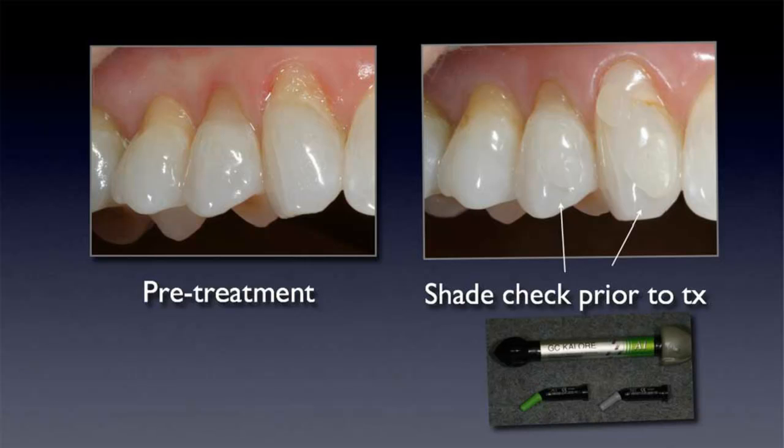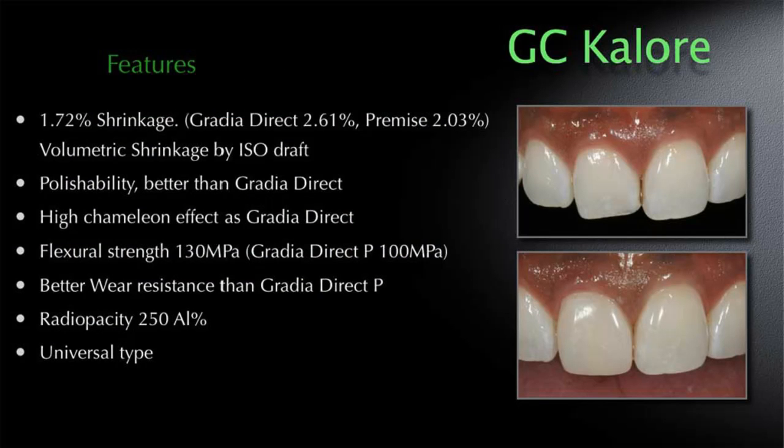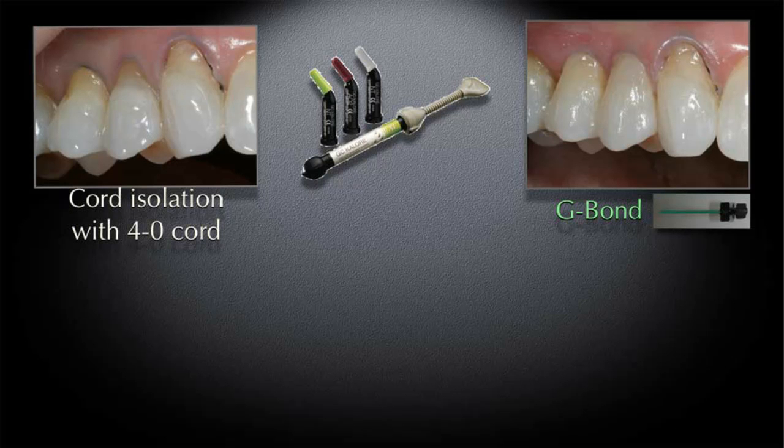And so now going to my technique here, one of the things I do, first of all, is I always do cord isolation, and I use something that's not typical. I don't use the actual cord packing cord that you normally would buy. I use a suture cord. The suture cords that I use are ones on a spool that you use for suture material. This is something that you can buy. It's like thread on a spool, and you can actually get it from your dental supply company.